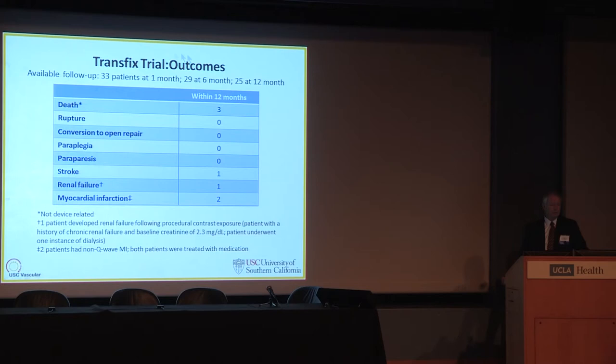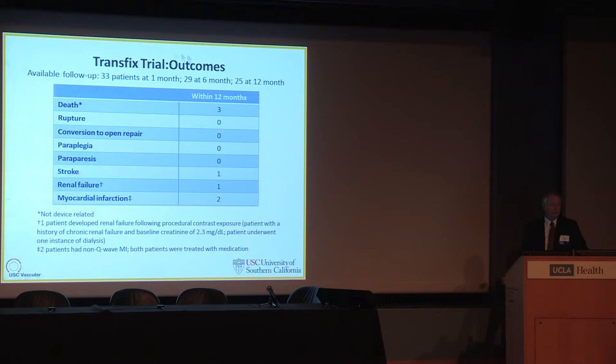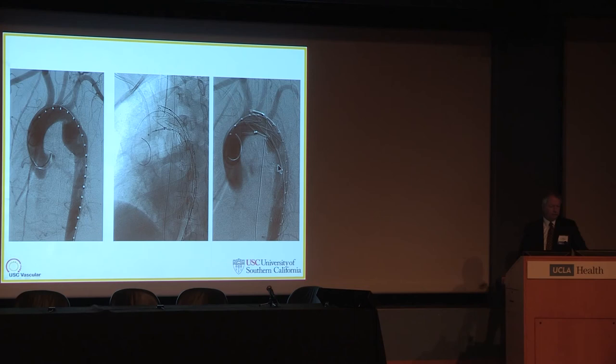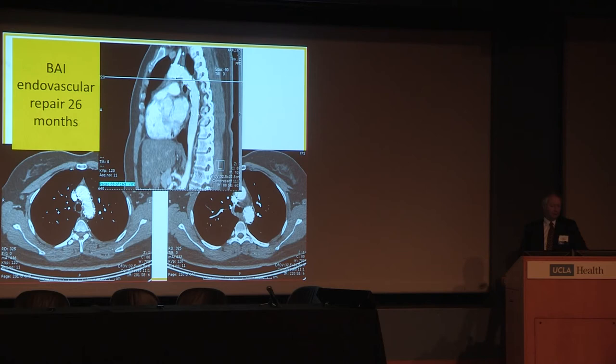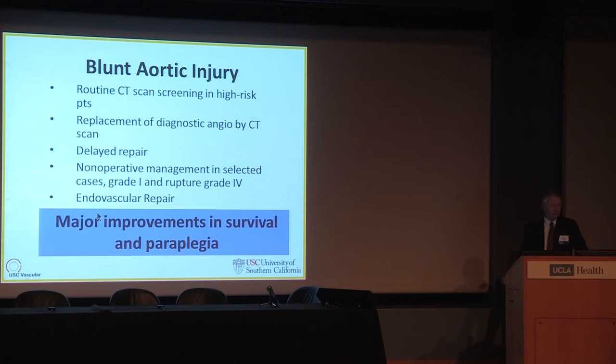The TRANSFIX trial from Cook showed similar results, with three deaths all related to traumatic injury, not the actual aortic injury — superb results with regards to treatment of the aortic injury. One patient with a grade 3 injury treated early on showed at 26 months follow-up a really nice result with complete resolution and healing of that aortic injury. The management of blunt aortic injuries has really changed.